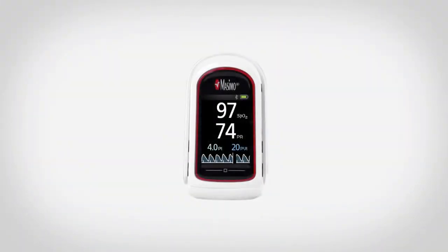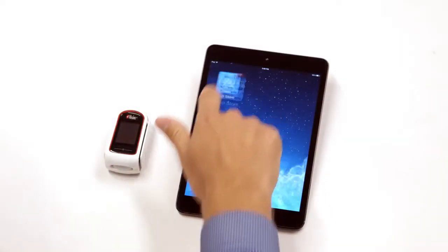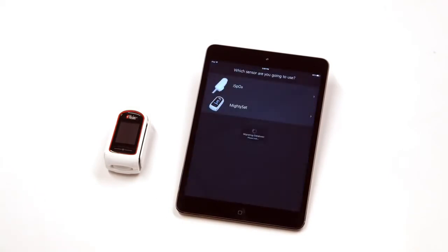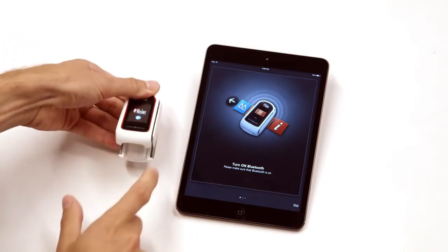To use the MightySatRx with your compatible smart device, do one of the following: for Android-powered devices, go to the Google Play Store; for Apple devices, go to the App Store. Search and download the Masimo Professional Health app. When the download is complete, launch the app and select MightySat to connect the MightySatRx with a compatible smart device.